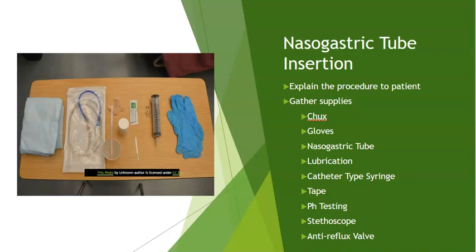Some people prefer to have a patient use a cup of water and a straw to swallow while they're inserting the tube. I don't use it myself personally. Another thing you might want to hand the patient is an emesis bag.